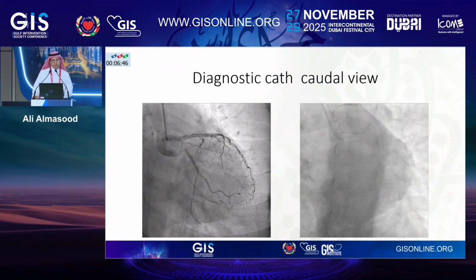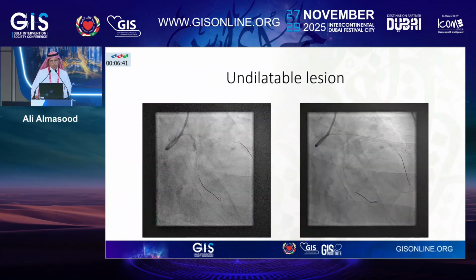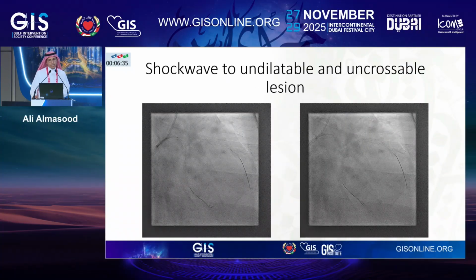We need to prepare this lesion very well because of the heavily calcific segment. So this is the initial balloon dilation. You can see an undilatable lesion. So we went ahead with shockwave, and I would like to highlight the technique that we used in this patient, because you know the shockwave is a bulky balloon, so it's not easy to push it in a tortuous vessel or acute angle. So we could not push the shockwave over this ostial circ.